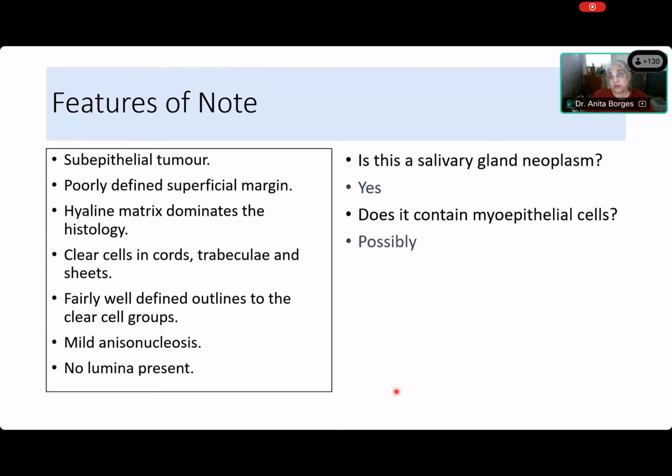It may or may not be. How do I know whether these are truly myoepithelial cells or not? Because myoepithelial cells can be very clear. In myoepithelial cells, you get basaloid, small cells with very indistinct cytoplasm and small nuclei. You get plasmacytoid, you get spindly, you get oval, and you get clear. So now tell me why these cannot be myoepithelial cells. And myoepithelial cells produce matrix. They produce all kinds of matrix.